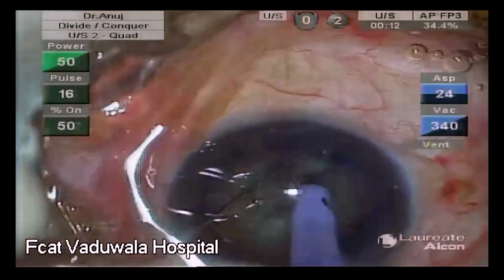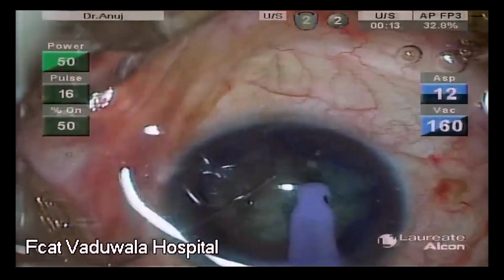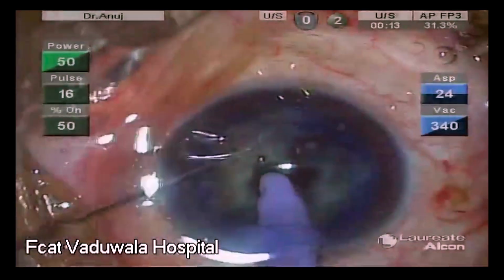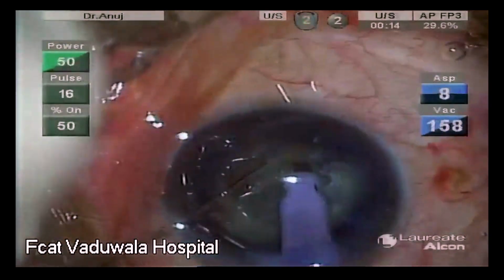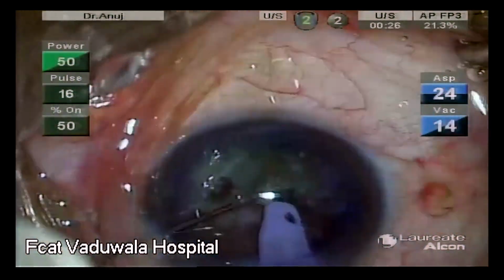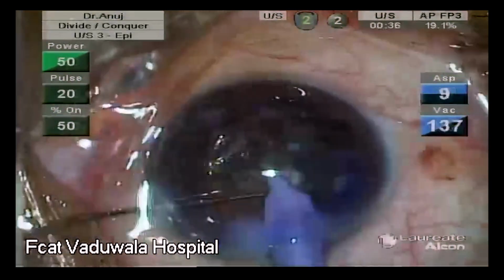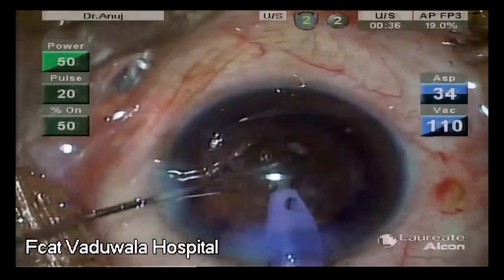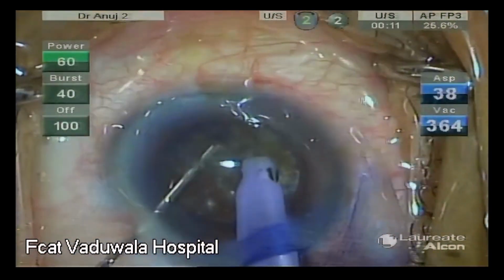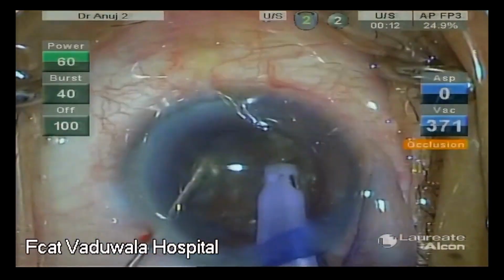A point to remember is, the more the number of fragments, the less will be the power used to emulsify them. We can decide how many nuclear fragments we want to create in every case depending on the density of the nucleus. Hence, the overall phaco energy consumption in this technique is significantly reduced for the entire emulsification process.